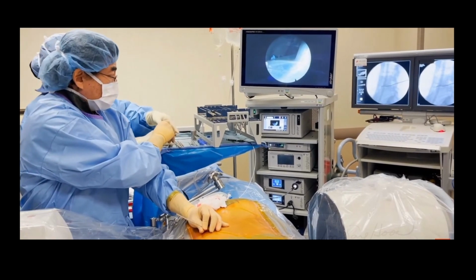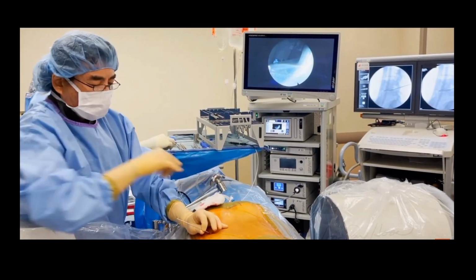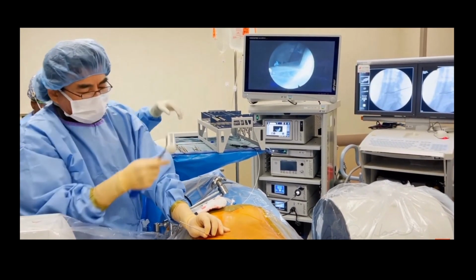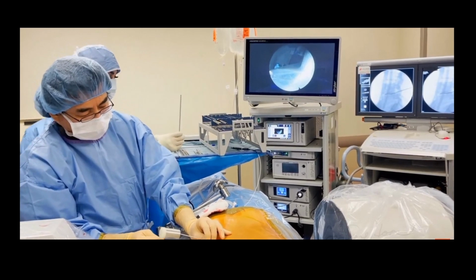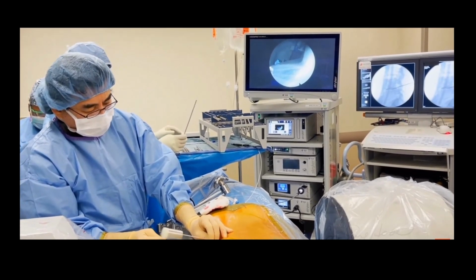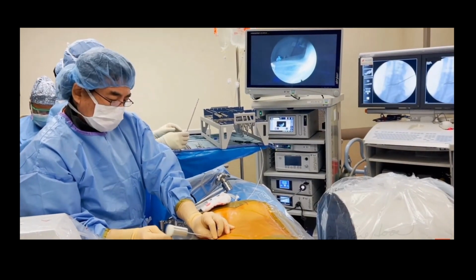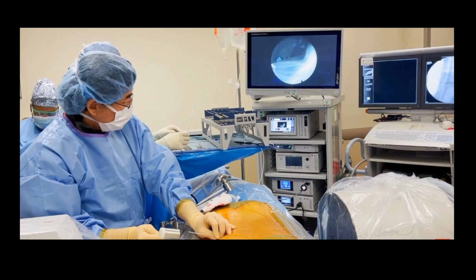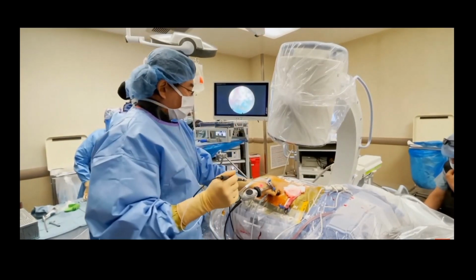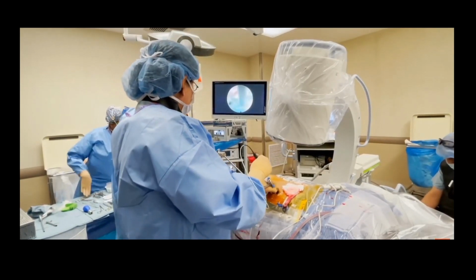Beyond these procedures, there are more advanced interventions for severe or refractory cases. These include endoscopic discectomy and foraminotomy, which are more invasive and typically require hospitalization. Endoscopic discectomy involves removing part or all of a herniated disc through an endoscope, whereas foraminotomy entails enlarging the foramen to relieve pressure on a compressed nerve root. Both procedures are often performed under fluoroscopic guidance to ensure precision and safety.